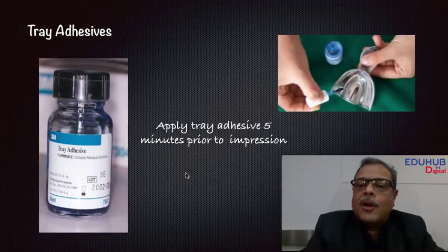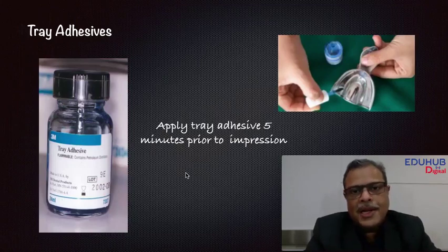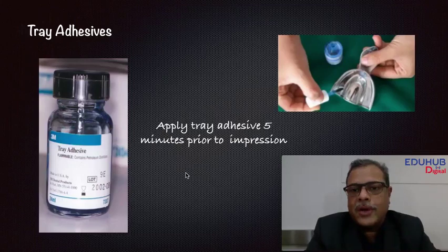Tray adhesive: a lot of people think that perforation in the tray is enough for allowing the material to get completely seated on the tray, but unfortunately, because the material is so rigid, it can easily distort. More than that, it can just displace itself from the base of the tray.